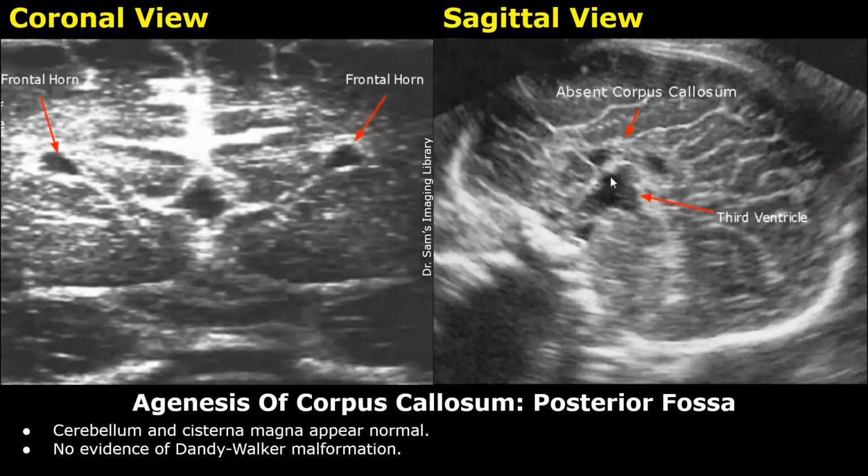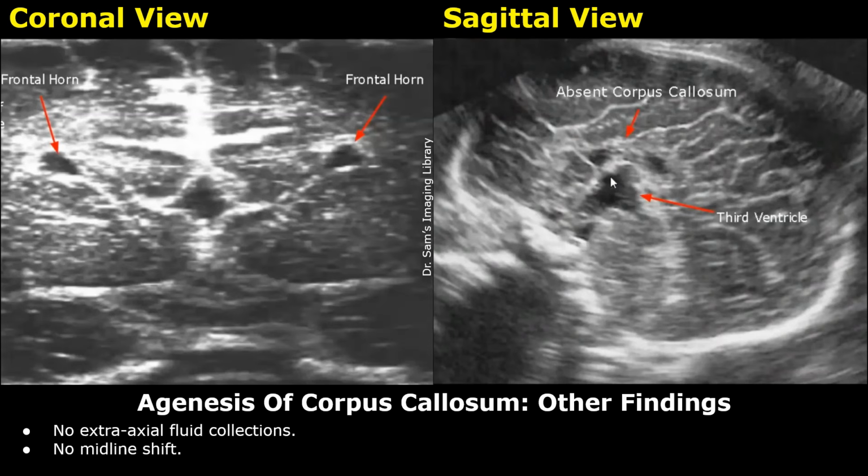Cerebellum and cisterna magna appear normal. No evidence of Dandy-Walker malformation. No extraaxial fluid collections. No midline shift.